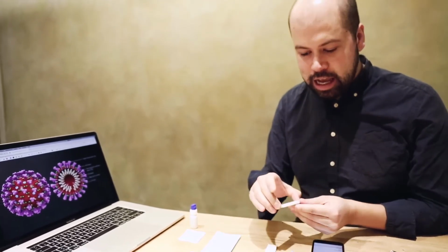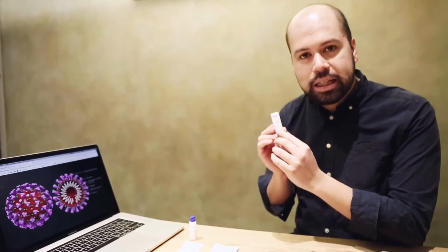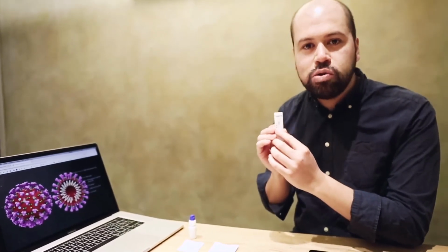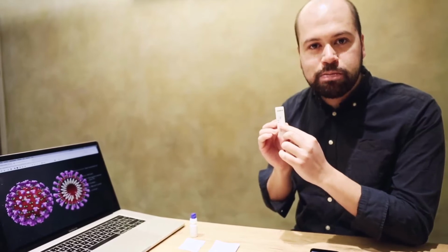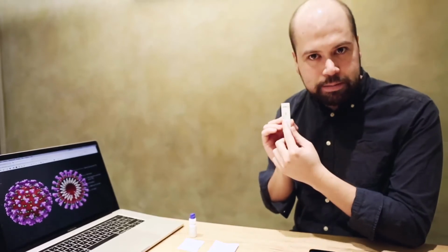There are tests called serologic tests that use these antibody signals, or bind to these antibodies produced in the body, to give a response on whether one has been infected with the virus or not. They measure two antibodies: one is IgG and one is IgM, immunoglobulin G and immunoglobulin M.